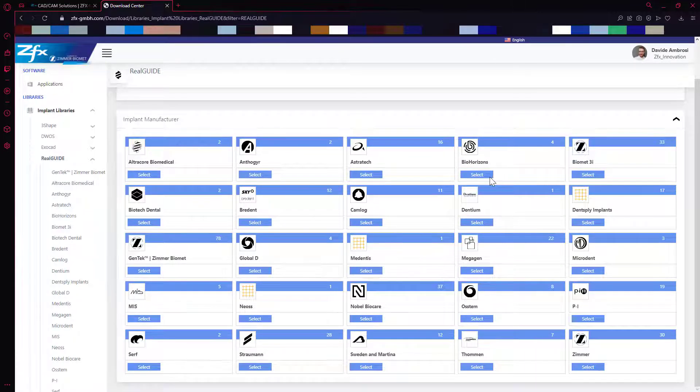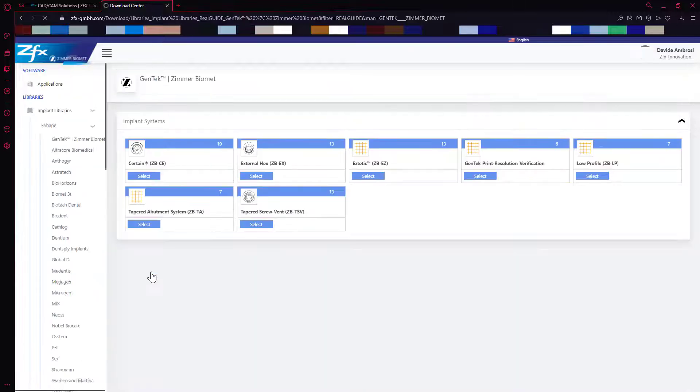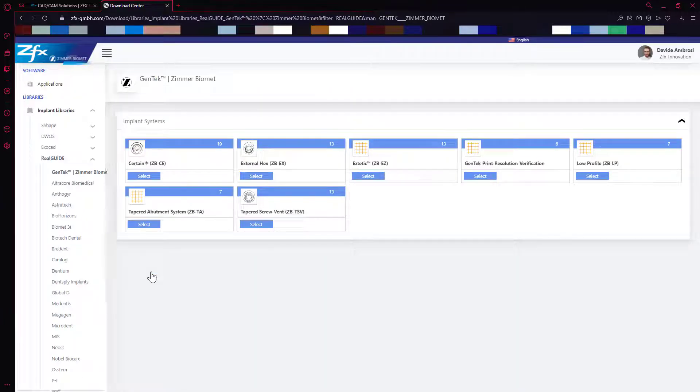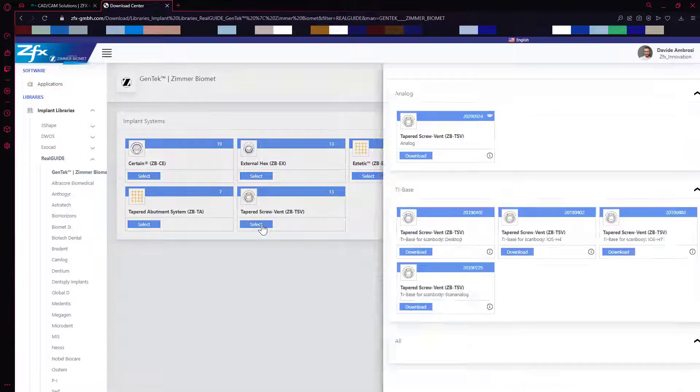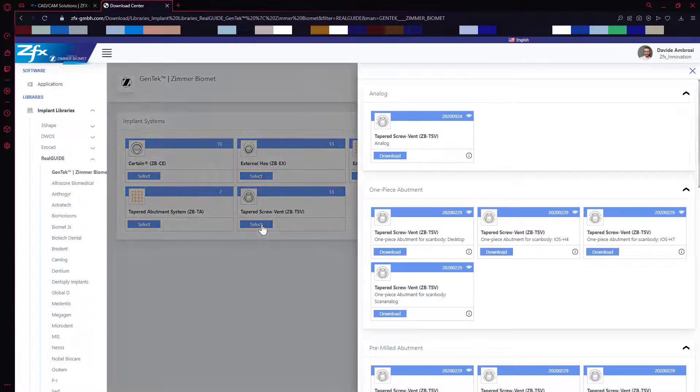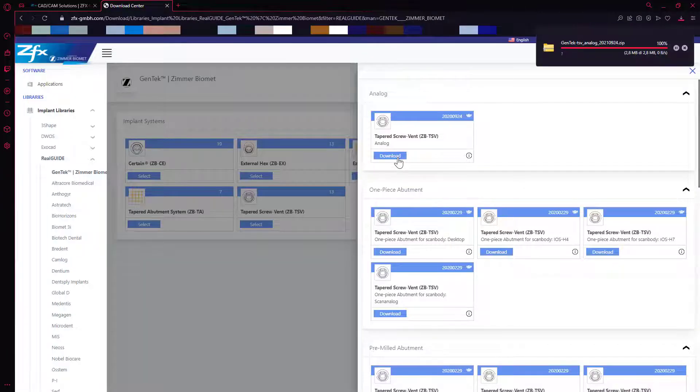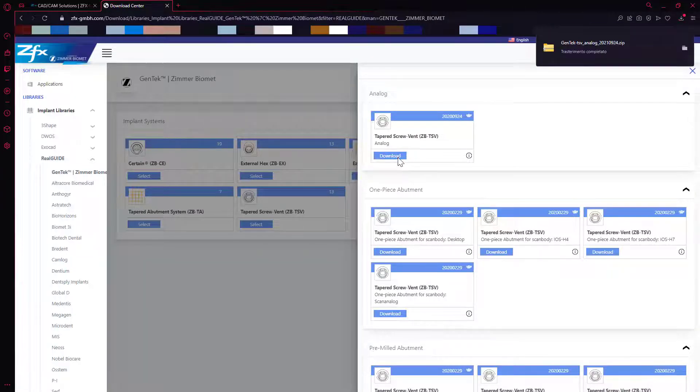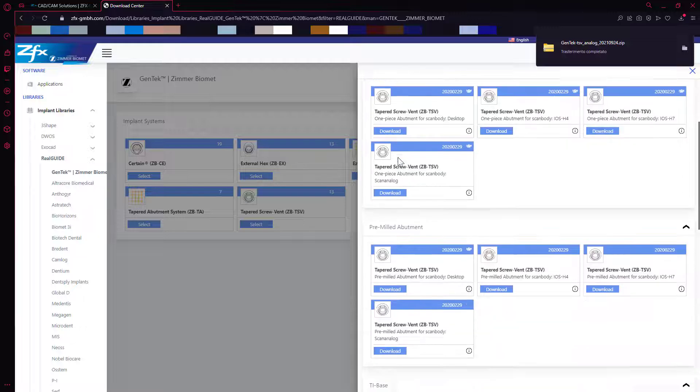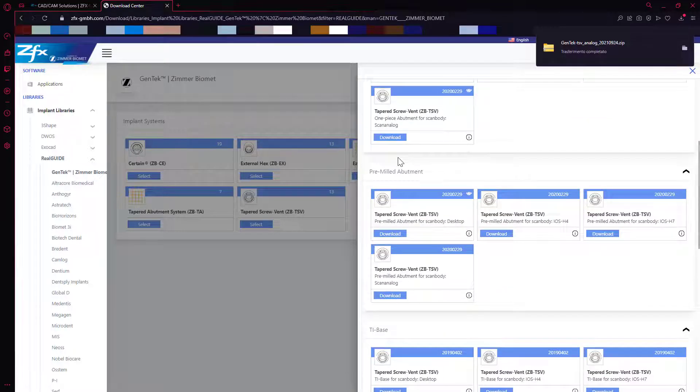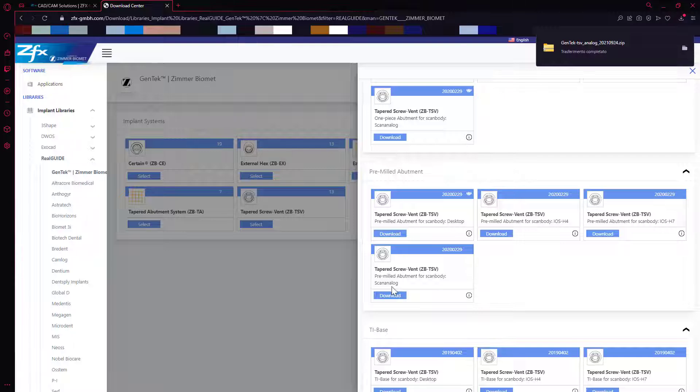Select the desired implant house. In this case, we will download the libraries for Gentek Zimmer Biomet Screw Vent TSV. We download the analog library for the creation of the models, and now let's download the pre-milled library to create an abutment.